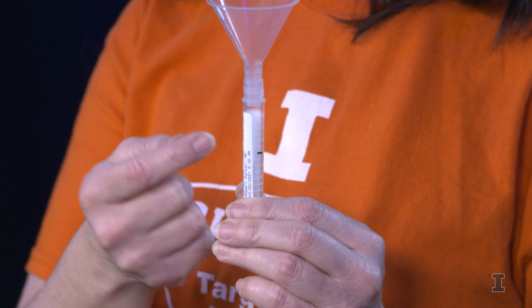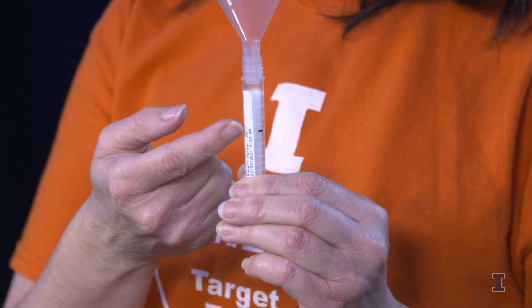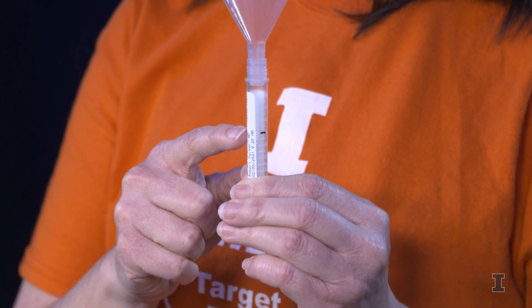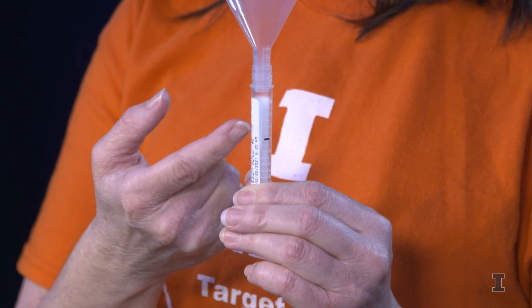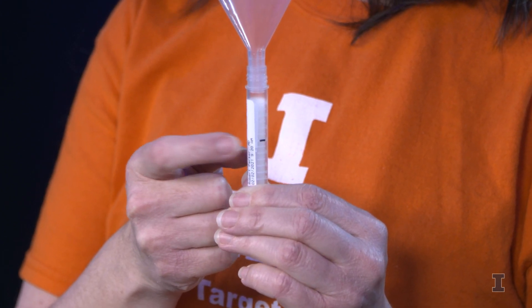Next, you are going to take a look at your test tube. Has it reached the 2 mL line? If the saliva isn't to the 2 mL line, you are going to keep the process up and try again. If you see that there is a big air bubble in your tube, you can gently tap the side of your tube to help pop the air bubble.